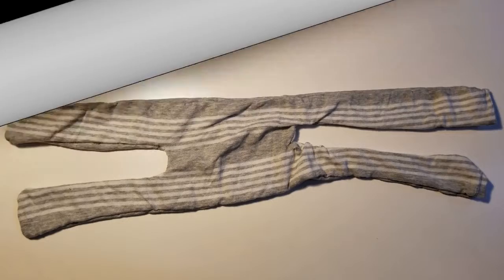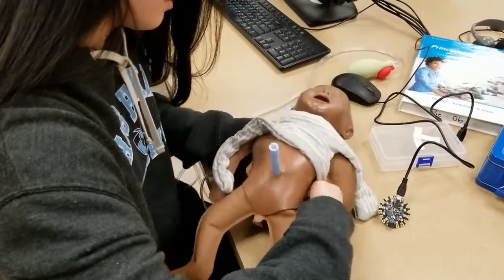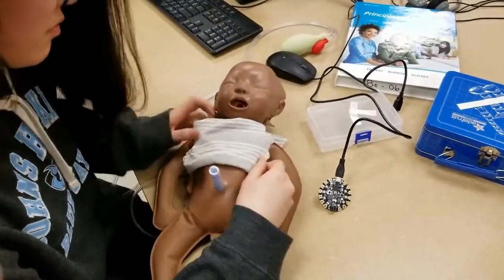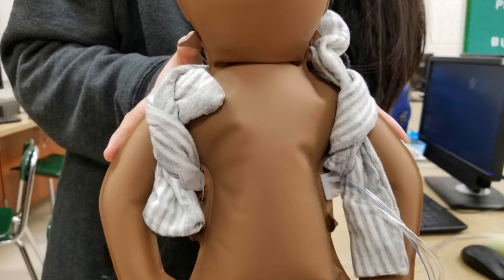We also created a harness that would hold the circuit in place on the baby. The device had to be a practical size as we were dealing with newborn, potentially premature infants. Along the same vein, the device had to be comfortable and easily fitted onto an infant's body, both for the baby's sake and the parents'. Lastly, the harness was created to go either around the infant's back or around the arms, to be usable when the baby is both swaddled and unswaddled, respectively.